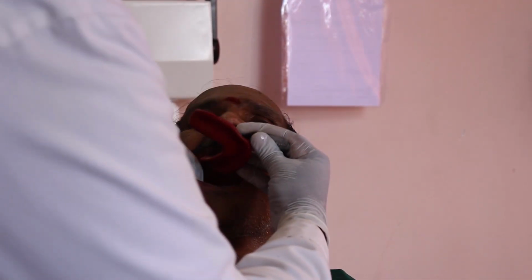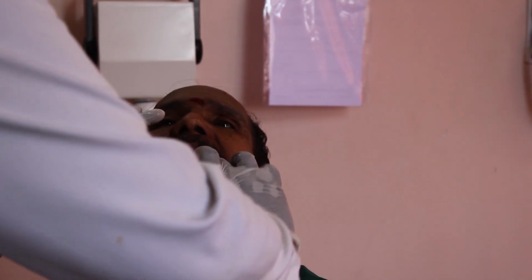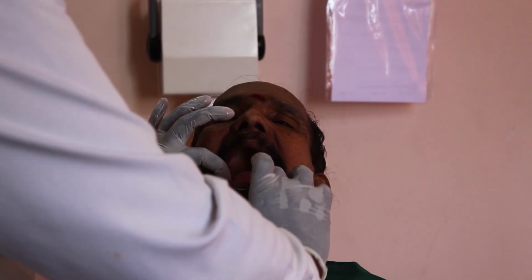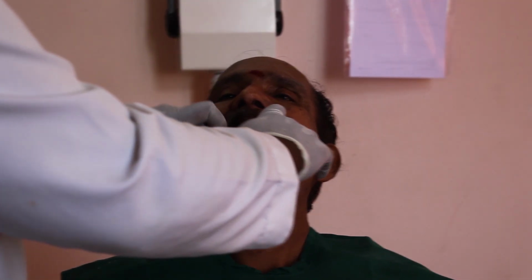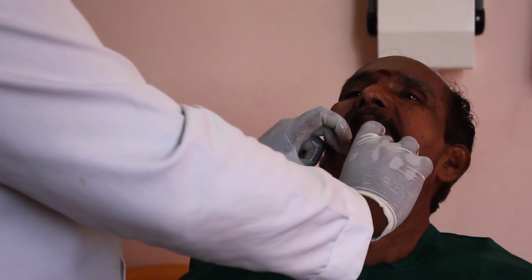So I am going to make the impression. The operator has to stand in front of the patient, and you have to reflect the soft tissue at the corner of the cheek. Then you have to rotate the tray into the patient's mouth, and you have to center the impression onto the center of the alveolar ridge. After placing it, you have to make sure that it is positioned correctly onto the alveolar ridge, and you have to apply the seating pressure.